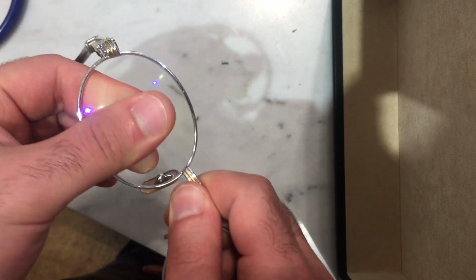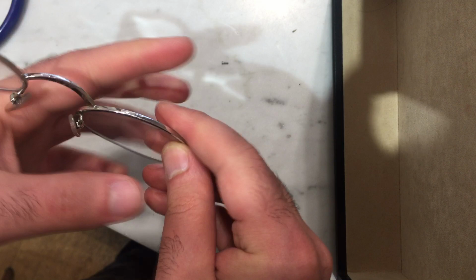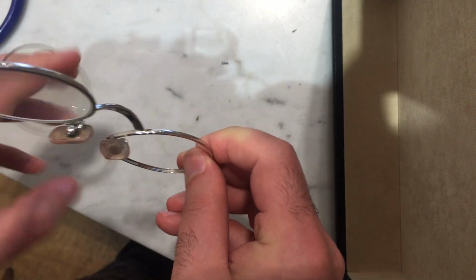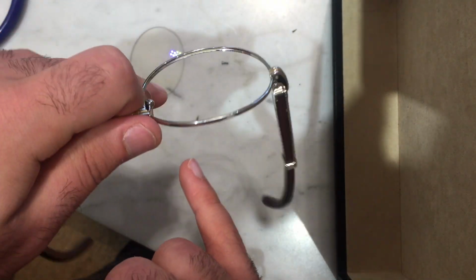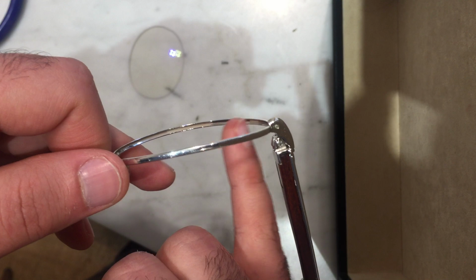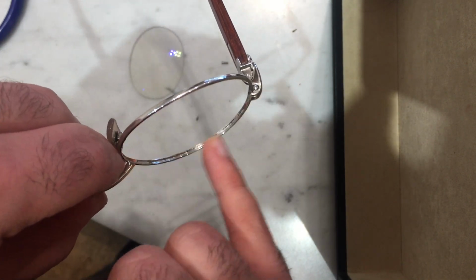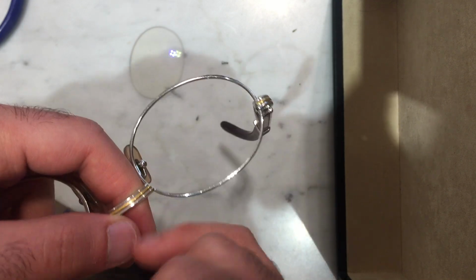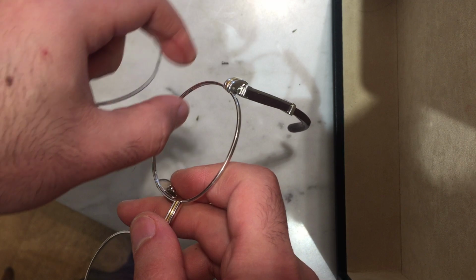So essentially what's going on is that this lens is a tad bit small. The right thing to do, and I'll show you that it's been done before to this, I just don't have the things around, or I'm going to pretend to not have it for the sake of this video. There's some lens liner in here, which means whoever had this same problem with this pair of glasses, the other optician that tried to fix it did basically the right thing and put some lens liner in there, which basically adds an extra layer.